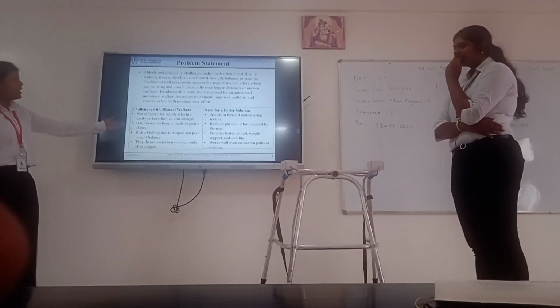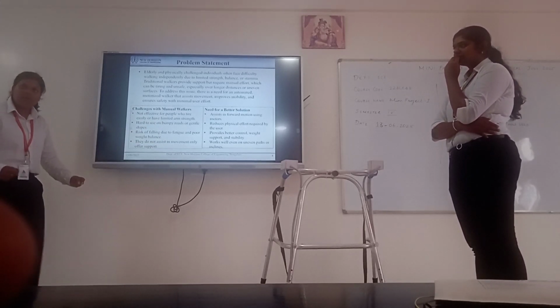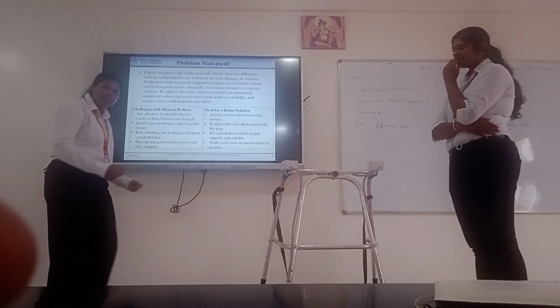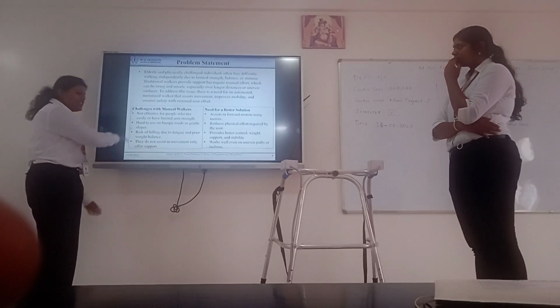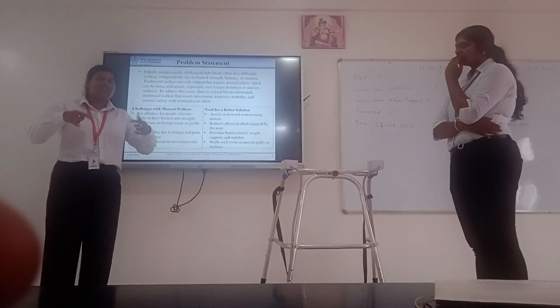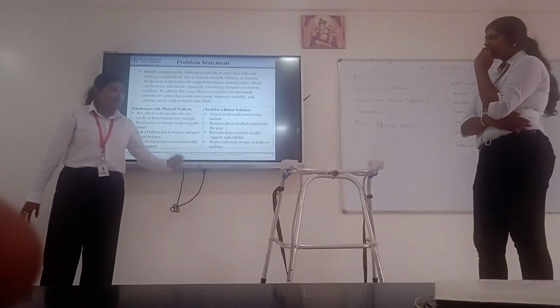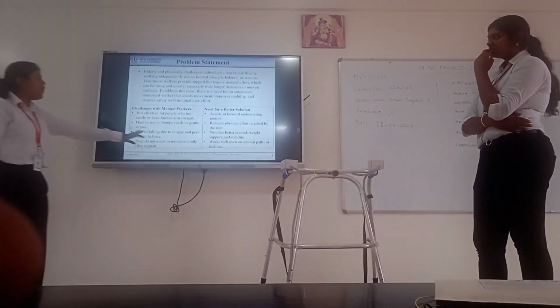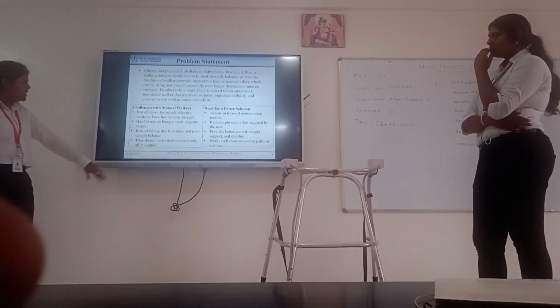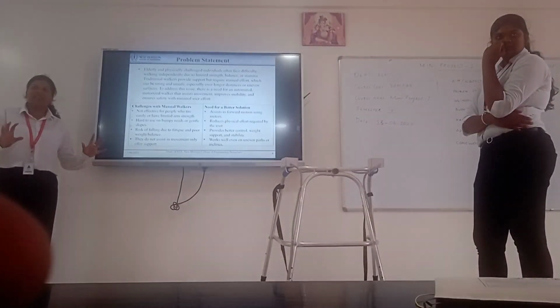Challenges with the manual walker: it is not effective for people who tire easily and have limited arm strength. As you can see, we are moving the manual walker stick, we have to move it manually. That's why we use this. It is hard to use on bumpy roads and gentle slopes, because if the manual walker does not have wheels, then when we are moving on bumpy roads or any staircase, it's hard for them, it needs more energy. There is also a risk of falling due to fatigue and loss of balance. They do not assist movement, they only give support.